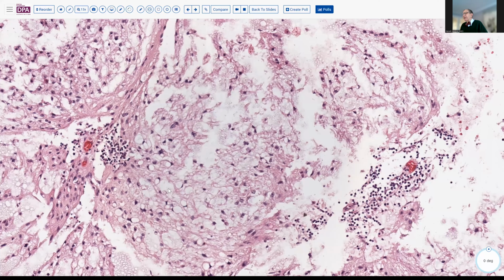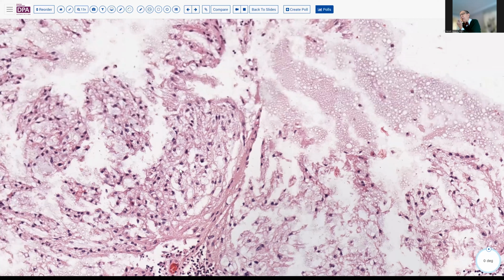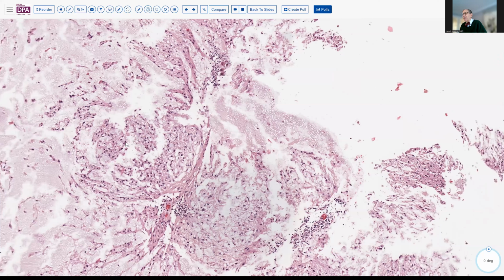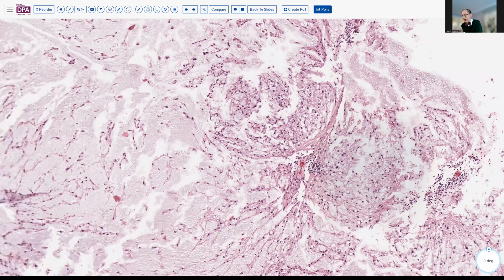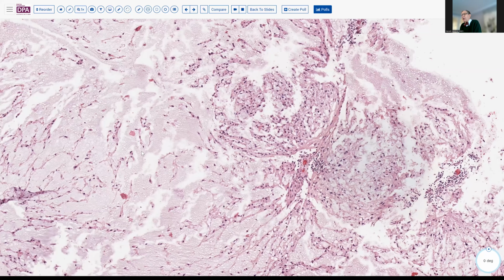And this is classically included in the differential with myxopapillary ependymoma based on this site. These are the two most frequently encountered lesions in this site that have this sort of myxoid-associated stroma or myxoid features. This tumor, in contrast, will be keratin positive, and so it can sometimes look like carcinoma, but it's also brachyury positive, which is considered the diagnostic sine qua non of the lesion.